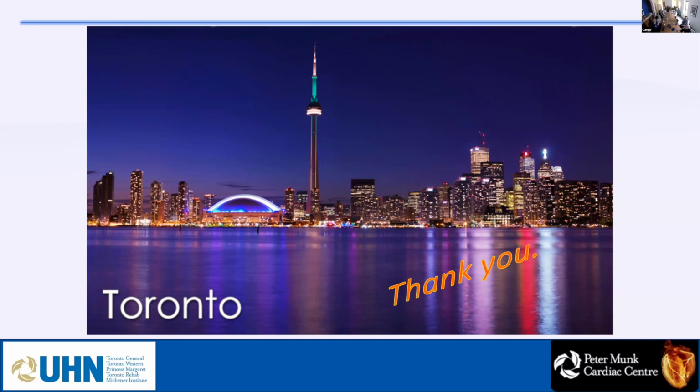as you see in my case number 4, I think the right was short. The left and the non were okay, but we replaced that valve. So any leaflet that is short, below 1.6, we should replace that valve. We cannot preserve it. The reason is this.